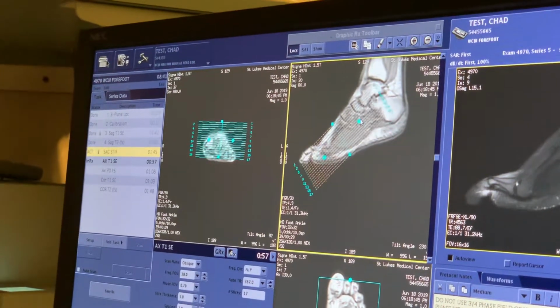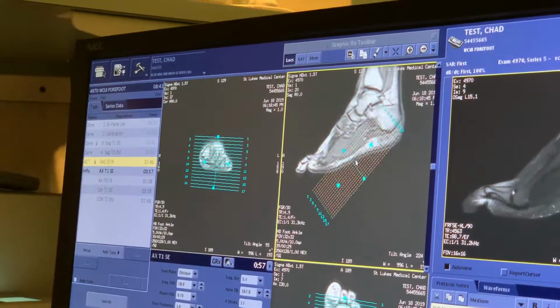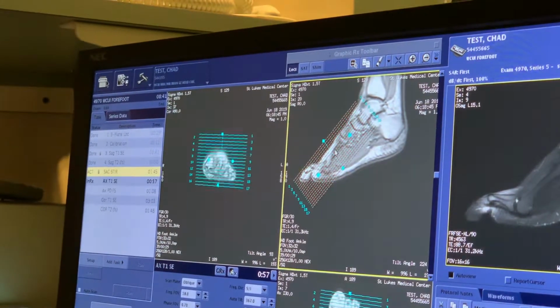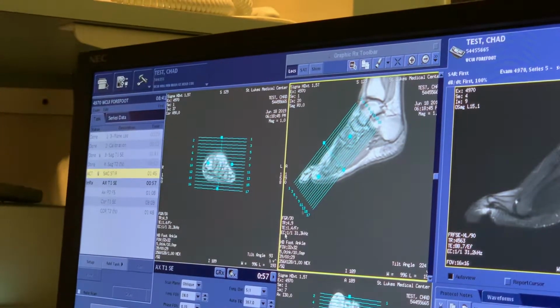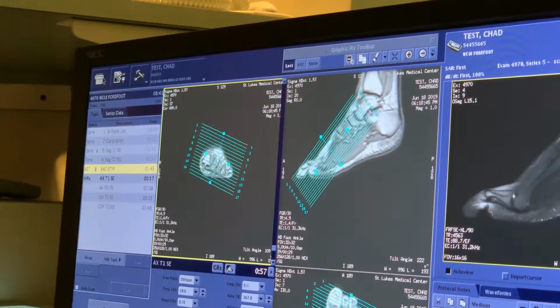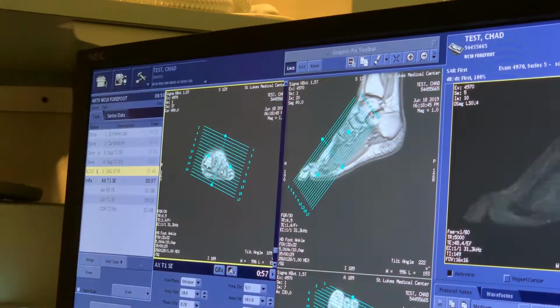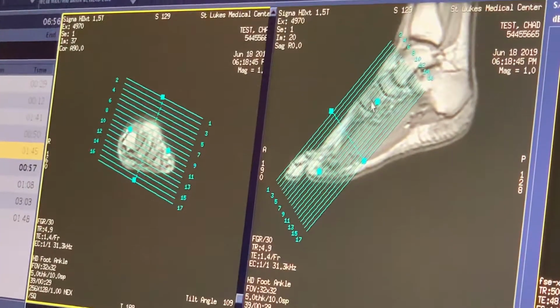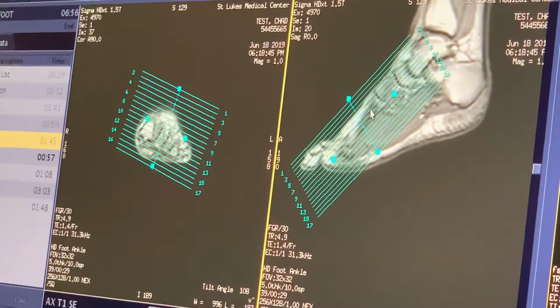So this I want to angle with the metatarsal. You see that metatarsal right there? I'm going to angle with it like that. I'm going to throw this up here like this. And in this plane here, I'm also going to angle with the metatarsals like that. So this is different than a hind foot, which is angled differently. Back that off just a little bit.